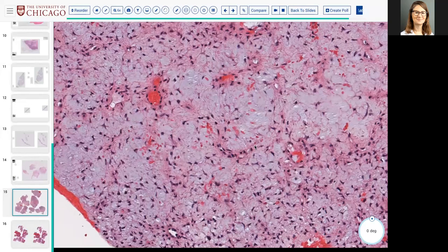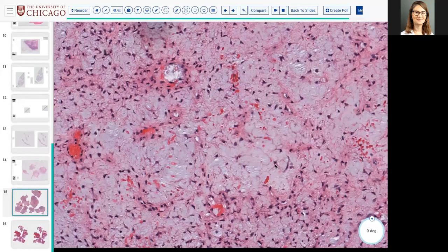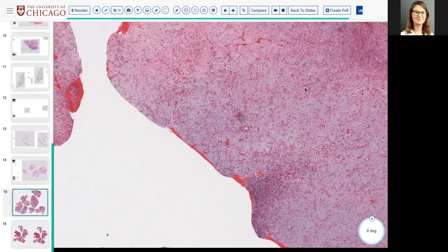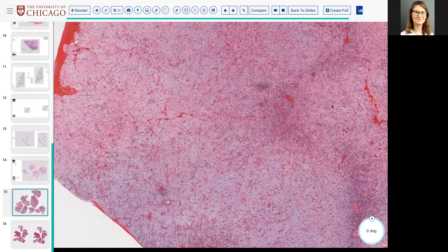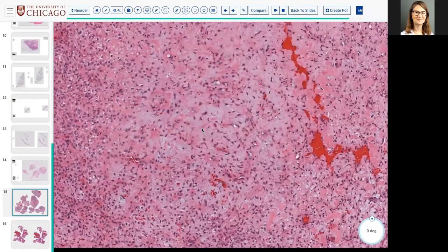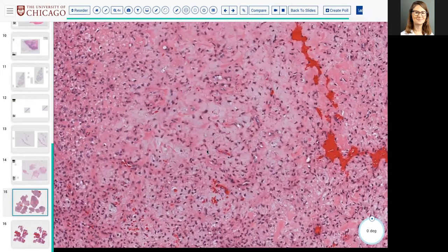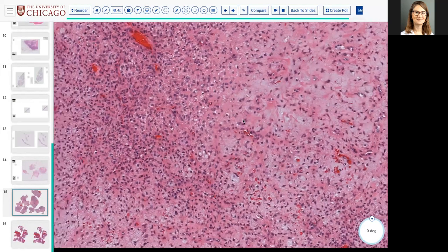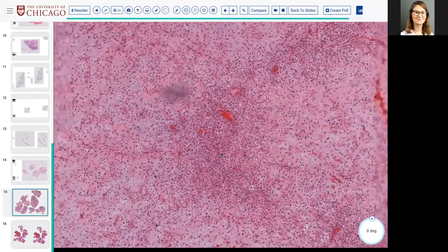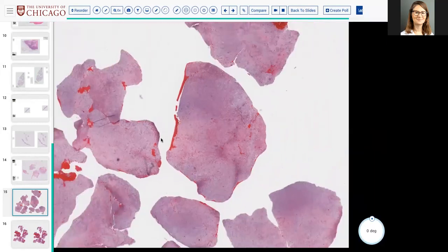So Anushmita is saying that she sees stellate cells with curvilinear blood vessels and might think about myxofibrosarcoma. Morphologically, that is certainly a possibility. But if we now know the context that this is an osseous lesion of a young person, then that makes that much less likely, because we would be looking for myxofibrosarcomas mostly in the deep soft tissue of an older person. All right.